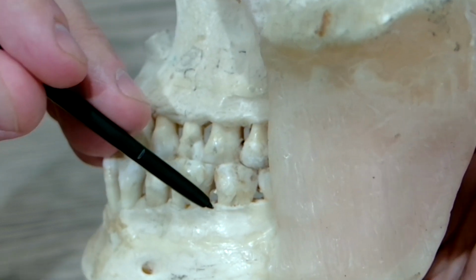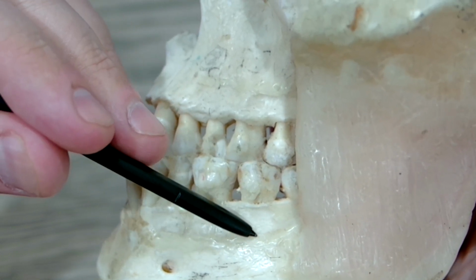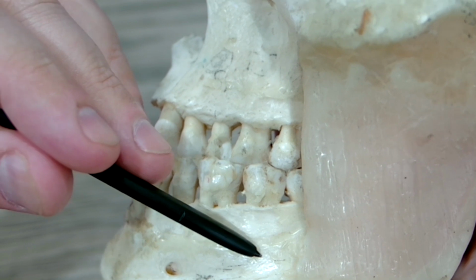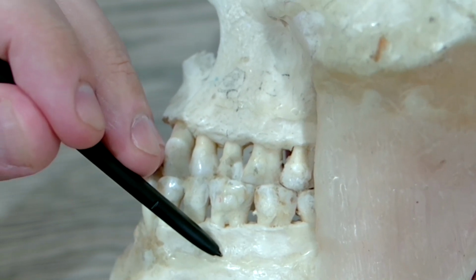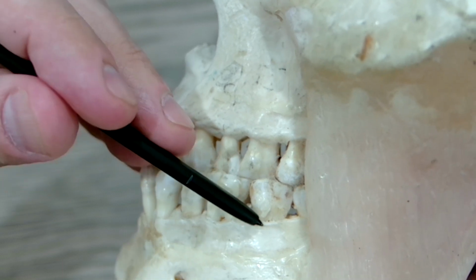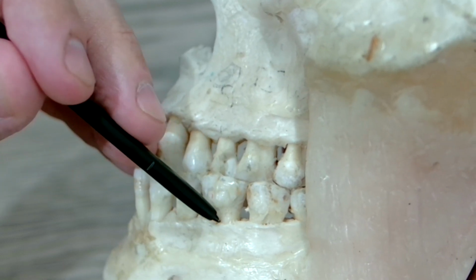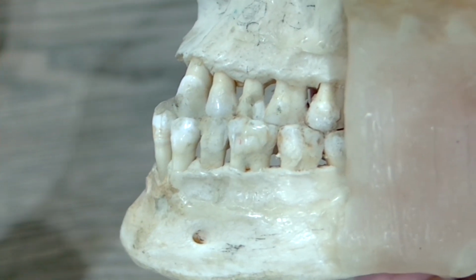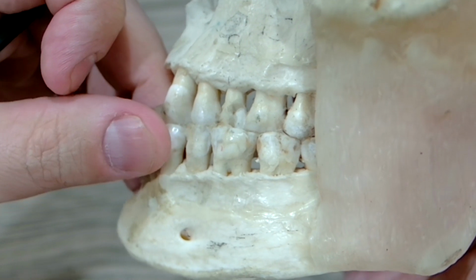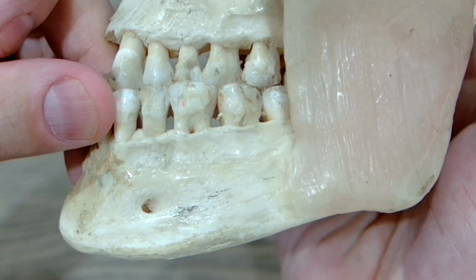When it comes to the second molar, that distance from the apex to the superior border is less than with the first molar. So keep that in mind. Typically with the second molar, you will have less vertical height post-extraction versus a first molar. So keep that in mind with the molar areas when you're doing implants.